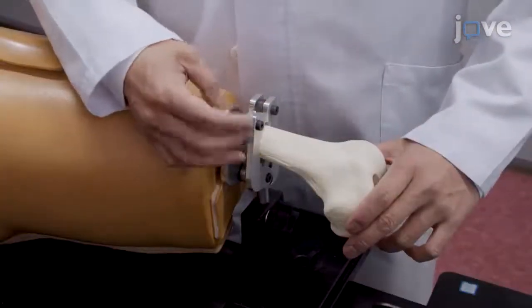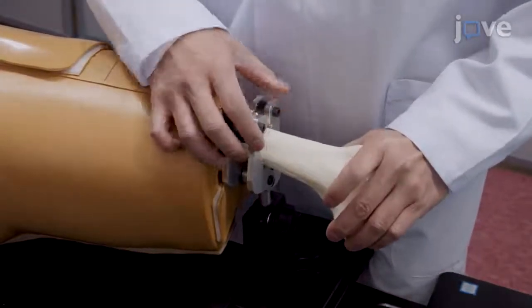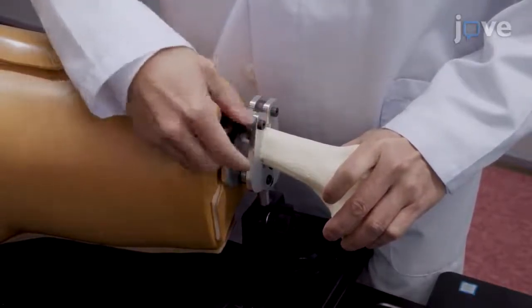Unlock the connecting part of the fixation device, then abduct and internally rotate the femur bone slightly to distance it from the pelvis and to generate joint space to mimic hip arthroscopy.